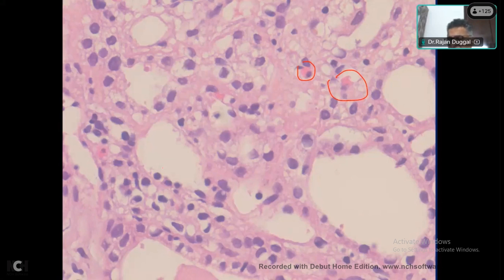If you don't give steroids to this patient, this acute tubular interstitial nephritis, the interstitial infiltrate will become more chronic, and then interstitial fibrosis will set in. And once the interstitial fibrosis sets in, it becomes an irreversible, chronic kind of damage. So at present, since there is interstitial edema and infiltrate, it is consistent with more acute tubular interstitial nephritis.